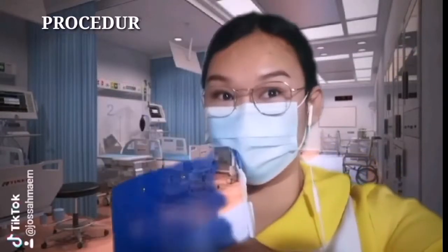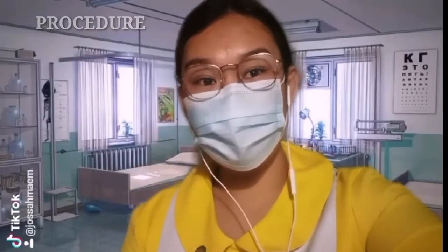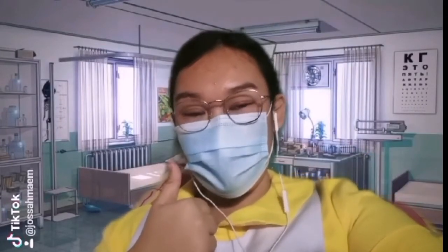Now let's move on to the procedure. First, you have to check and verify the doctor's order. Second, you have to identify your patient using two patient identifiers, which are the patient's full name and his or her birth date. Third is to put the hypo tray on the bedside table. Don't forget to perform hand washing and put on PPE if indicated.